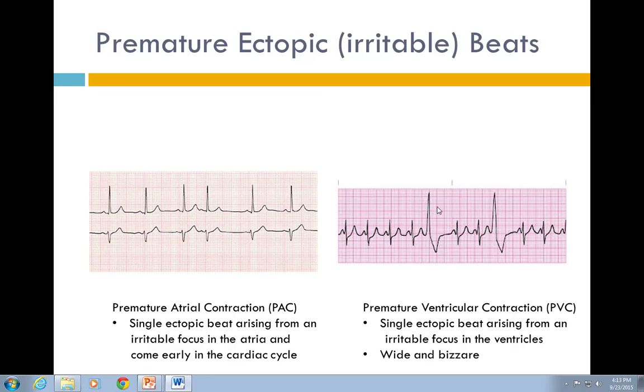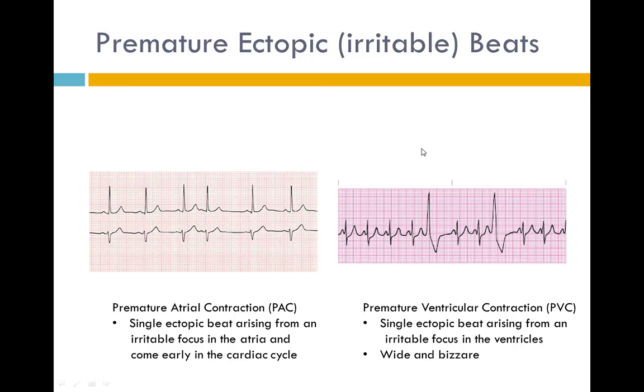Wherever that ectopy is occurring, you're going to see it morph into the rhythm itself. Okay? And I sort of lined out where the PAC is here in this one and where the PVCs are in this strip.